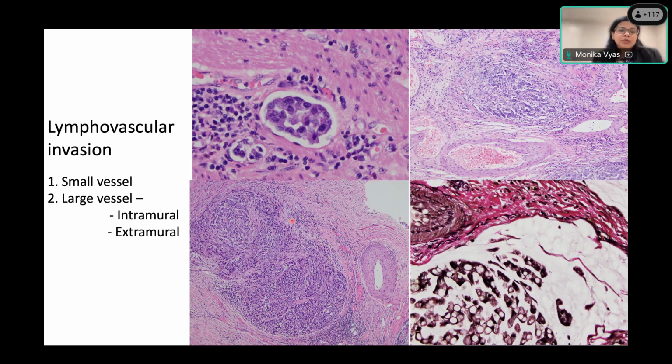So when you have large venous invasion involving the submucosa or muscularis propria, that is called intramural large vessel invasion. And that, even though significant enough to report, is not shown to be that prognostically significant. However, when you have large venous invasion beyond the muscularis propria, so involving the pericolonic fat, then that is called extramural large vessel invasion, and that has been shown to have a risk of liver metastasis. So you definitely want to report that.